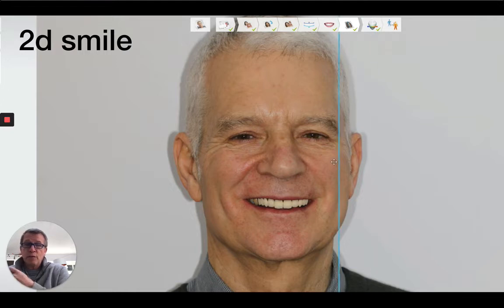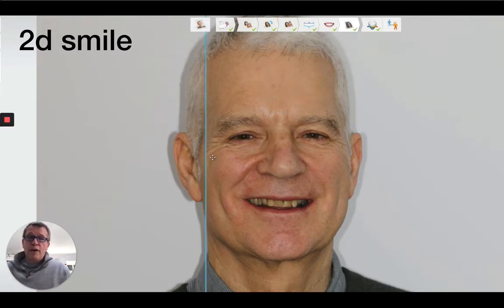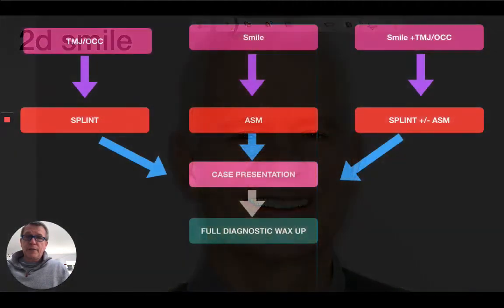And now, once they get interested, not only do they want to spend a bit more time on there, but they also seem to be a bit more willing to spend a little bit more money. I actually did this Smile Design, took me about 10 minutes. If you don't have it, you can also get the lab to do it for you. That just delays things and probably costs a little bit of money, but it's not desperately expensive. But it's a cool and great way of communicating with the patients.